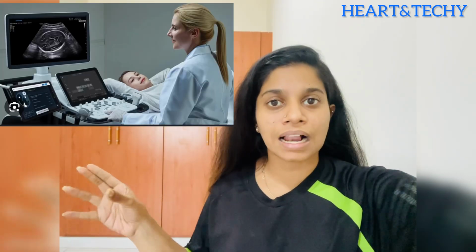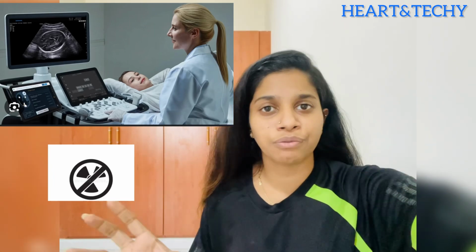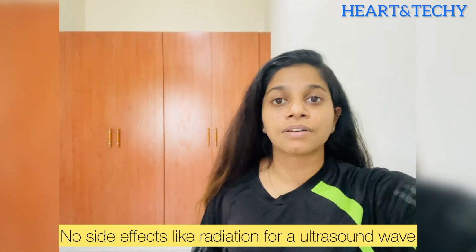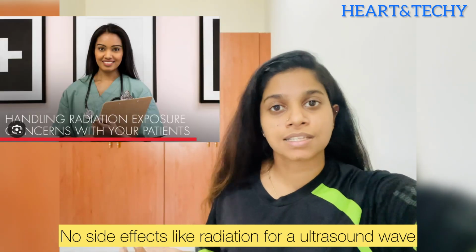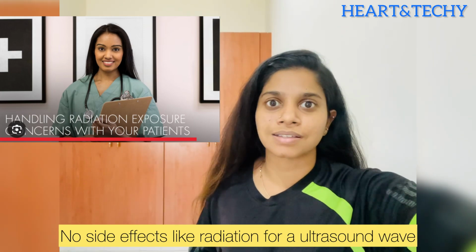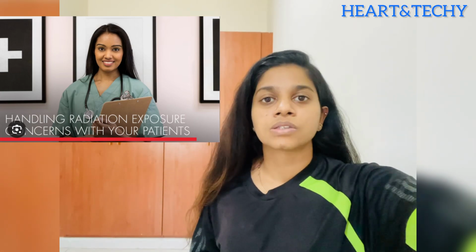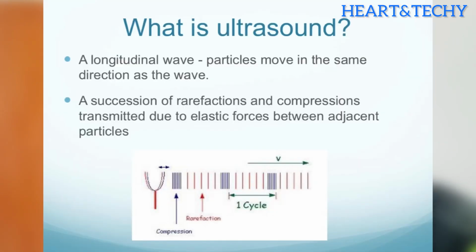But ultrasound is a special kind of wave which doesn't have any such side effects. Some patients who come for tests like ultrasound will ask us, is there any radiation in the test and is it harmful for me or not? That is the first question they ask. Ultrasound won't have any side effects. Ultrasound is a type of wave, and it is a longitudinal wave. A longitudinal wave has different areas of compression and rarefaction.